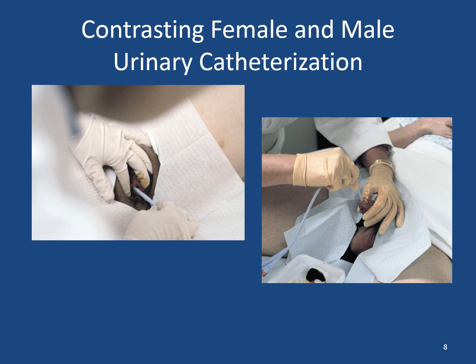Please remember that. Okay, so the catheter would be inserted smoothly and quickly in females. It can meet resistance inserting in male clients due to possible prostate gland issues. And it's also a longer distance from the meatus to the bladder for men.